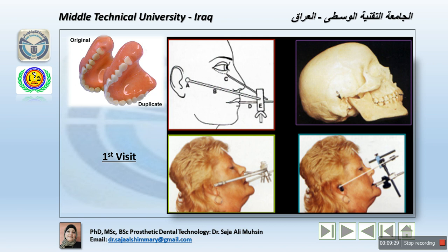If the previous old denture is not acceptable to the dentist and the patient, that means if we are duplicating the complete denture, what we can modify in the new one is not only the material but also correcting many things. We probably have some resorption of the bone, in the dimension buccolingually or mesiodistally. So in this case, we have different modified steps to check and to continue with the dental technician.